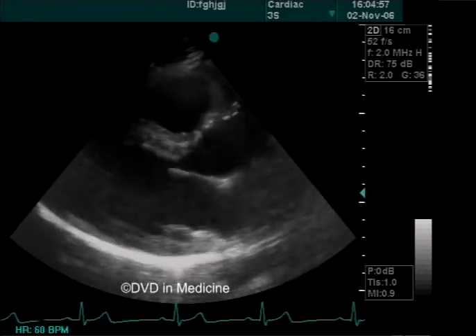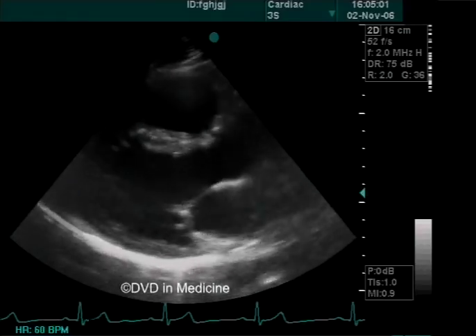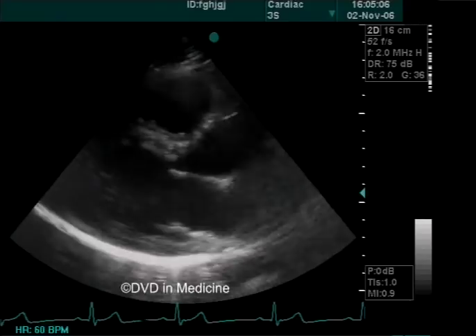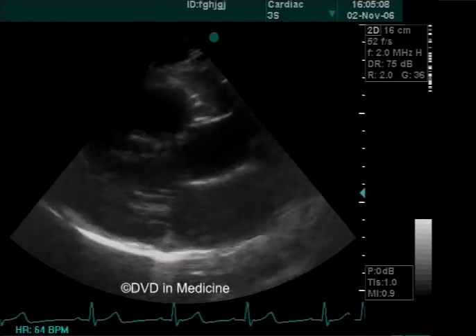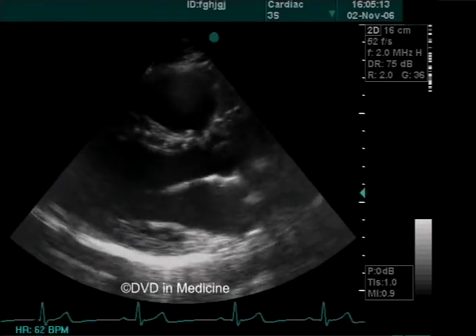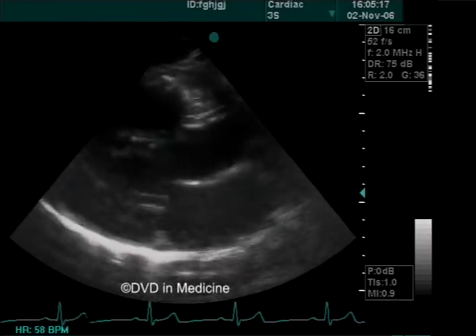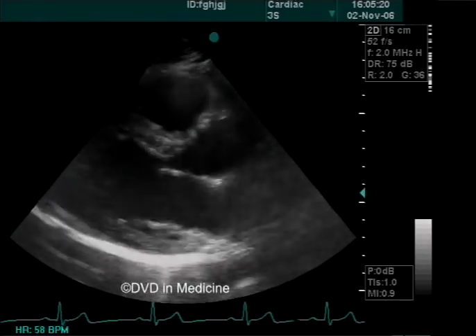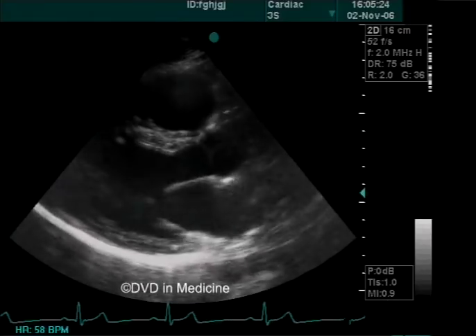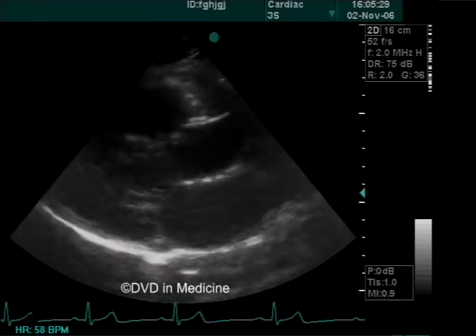4. To assess left ventricular systolic function. 5. To determine the amplitude of motion and thickness of the interventricular septum and posterior left ventricular wall. 6. To see membranous defects of the interventricular septum. 7. To confirm mitral aortic fibrous continuity. This is important in the diagnosis of some congenital heart diseases. 8. To diagnose structural changes and dysfunctions of the mitral valve and its supporting structures, cord, papillary muscles.